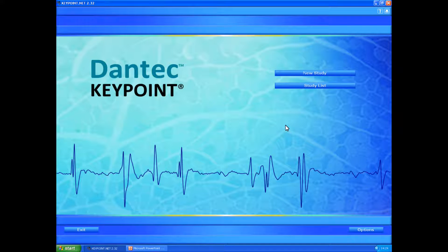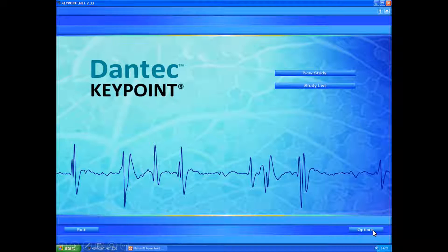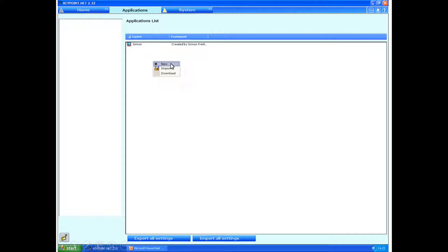From the home screen, there's a small button at the bottom of the page called options, which we will click. This brings up the applications list. If we right click here, it brings up a small little box and we can click on new.